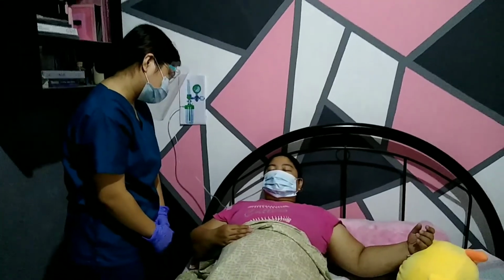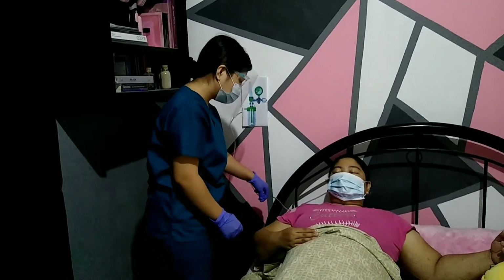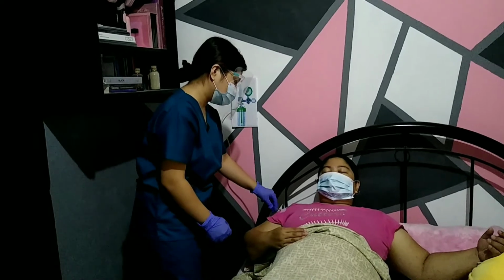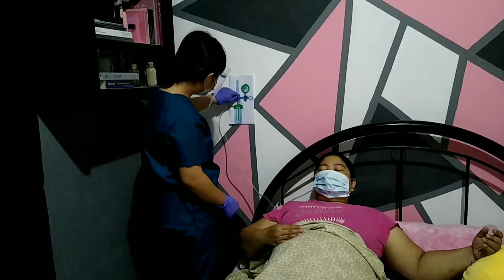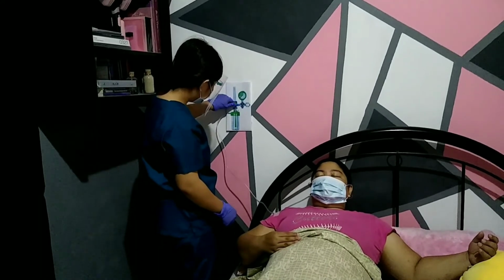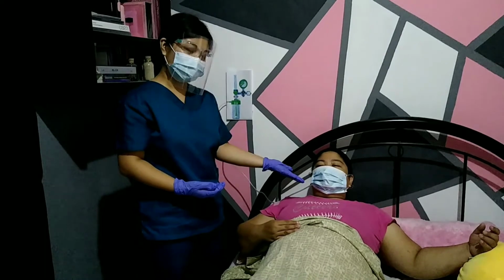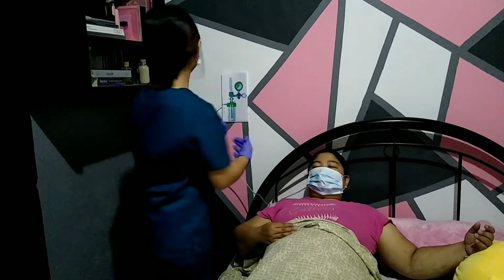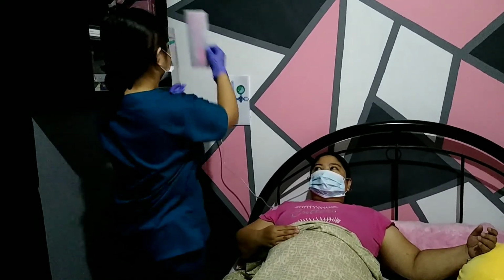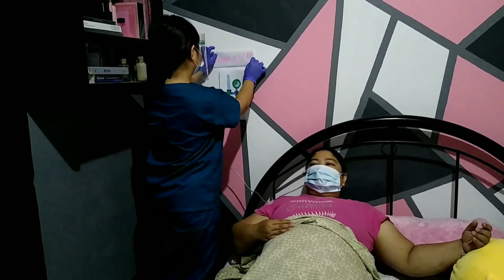And then observe the proper function of the oxygen delivery device. And then verify the setting on the flow meter and oxygen source for proper setup and prescribed flow rate. And then of course, don't forget to check the cannula or the mask every 8 hours and keep the humidification container filled at all times. And then post the oxygen in use signs as needed. Okay?